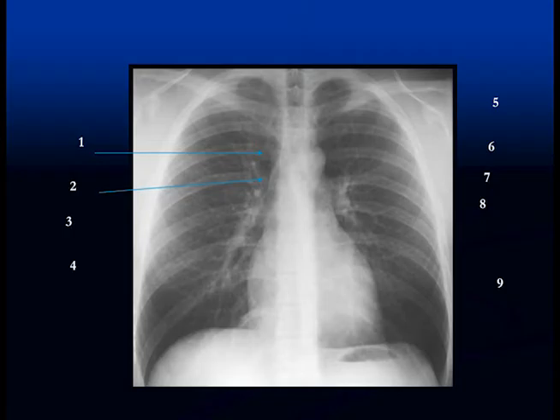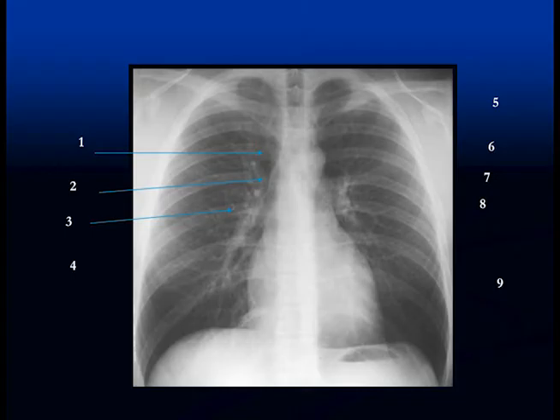The next structure is this little almond-shaped structure just above the right main stem bronchus — this is the azygous vein. The azygous vein is an alternate pathway for blood to flow from below the diaphragm up into the heart, and it actually empties into the superior vena cava.